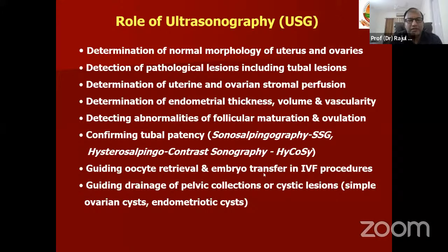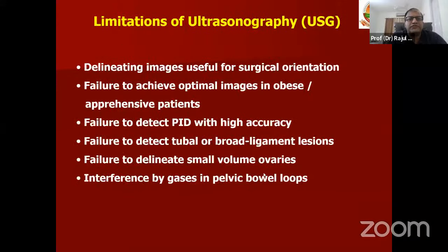Then ultrasound can help in oocyte retrieval and embryo transfer in all IVF procedures, and it also helps in guiding the drainage of pelvic collections and cystic lesions, specifically simple ovarian cysts and endometriotic cysts through the transvaginal route. But as we discussed briefly, it has a lot of limitations.